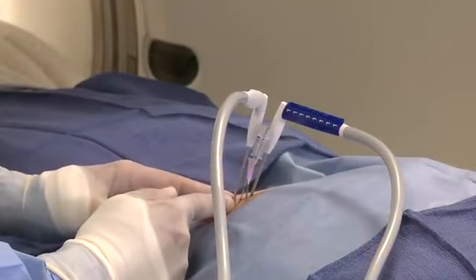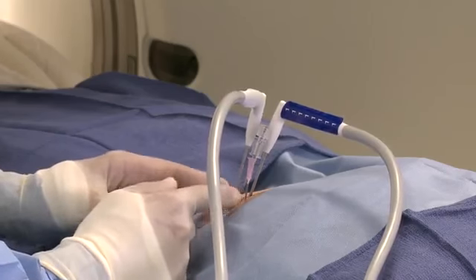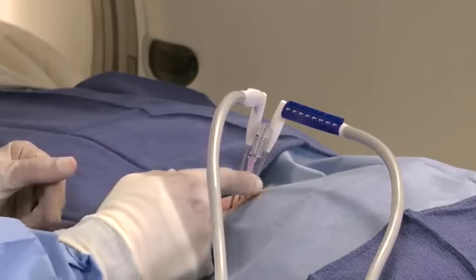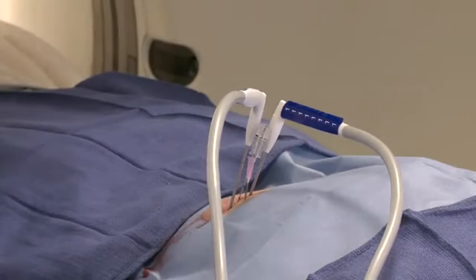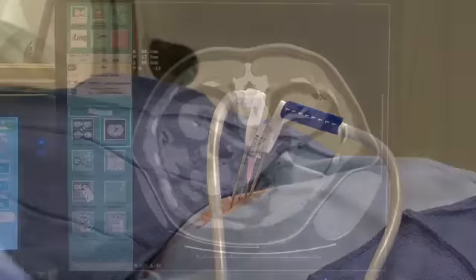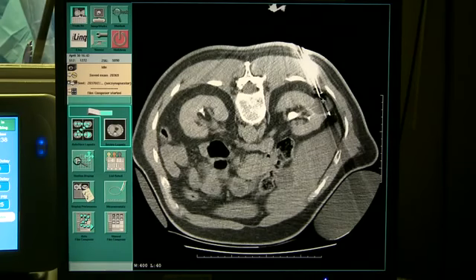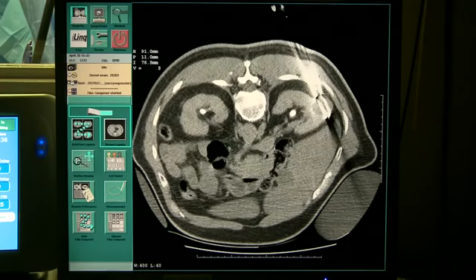So we'll center on these probes, and instead of doing 3 cuts, we'll do 5 cuts to make sure that we get a broader view of what's going on and to make sure we evaluate where that little pink guide needle is going to be. So here we are, we're going to go through the lesion. This is the original guiding needle from the biopsy, which is at the bottom of the lesion at this point. As we come up, we start to get into the 2 probes which are in place. They look side by side, but at the skin level they're off a few millimeters, as hoped for, staggered.